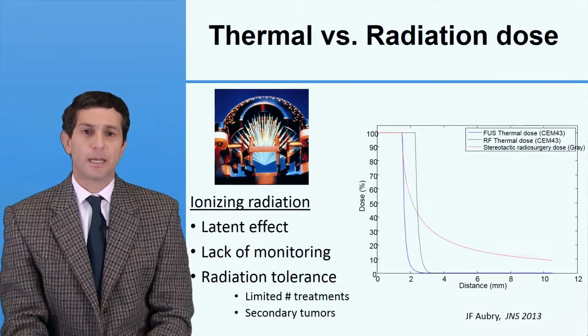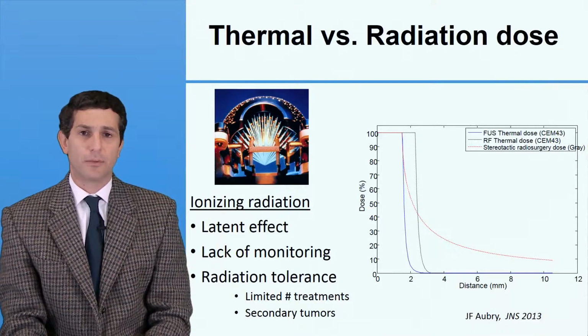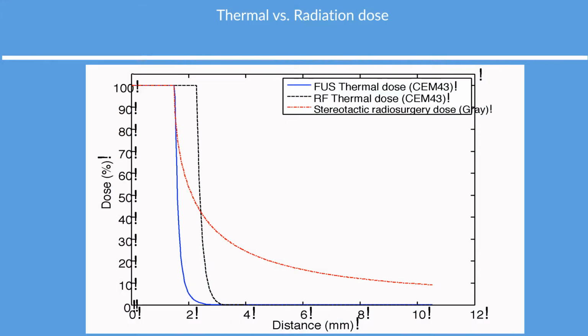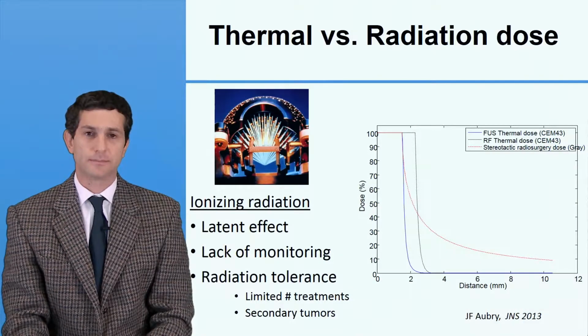Jean-Francois Aubry attempted to simulate our experiments with radiofrequency, focused ultrasound, and radiosurgery. And you can see that this graph nicely depicts the difference between thermal and radiation dose, where the drop-off is much sharper with thermal lesions than with radiation lesions.